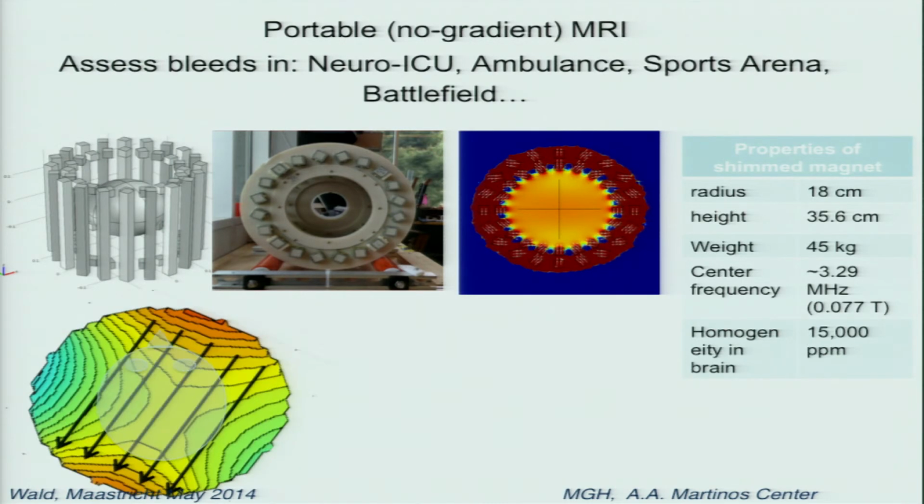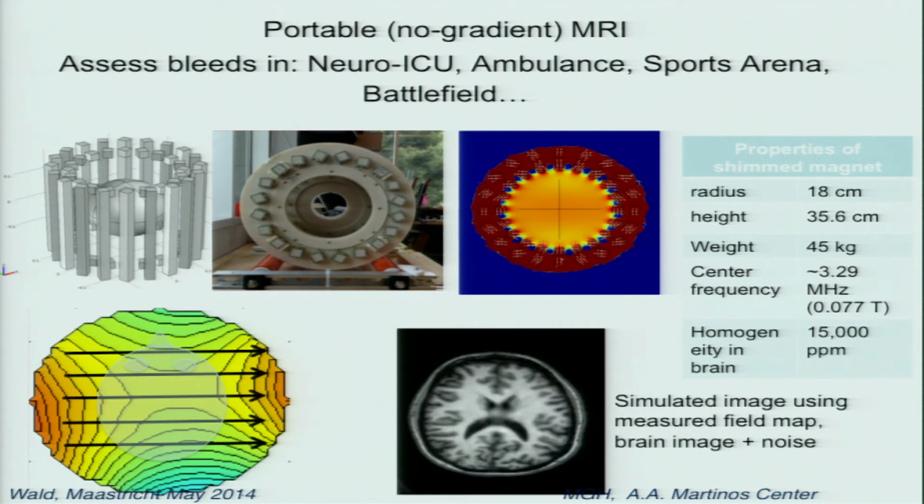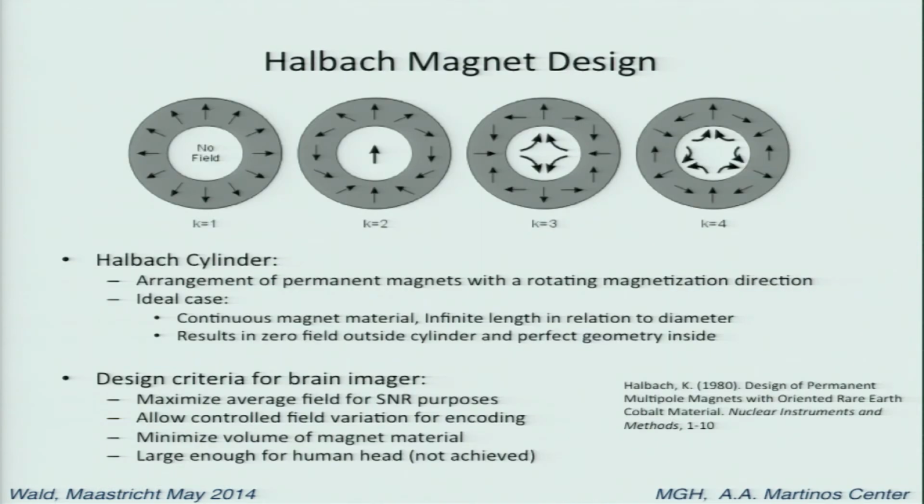We stick the head in, and then we rotate it around, taking spin echoes as we go to produce an image with variable resolution. Since the encoding field lines are spaced closest together near the edge, you're going to get the highest spatial resolution there. In the center, you actually get an encoding hole.